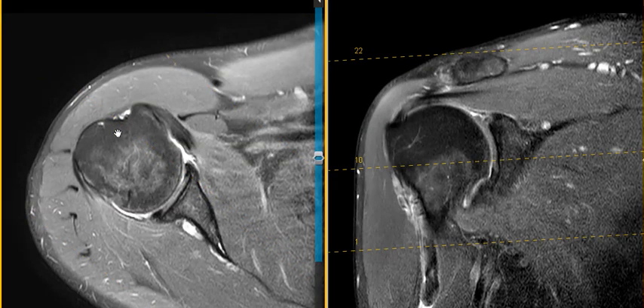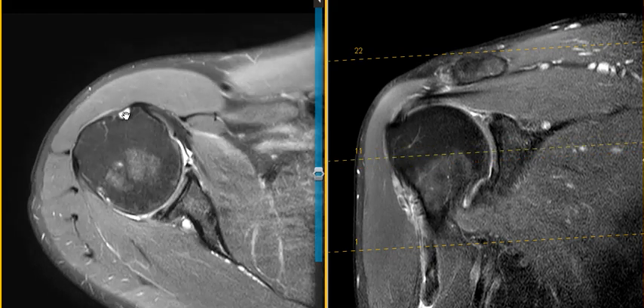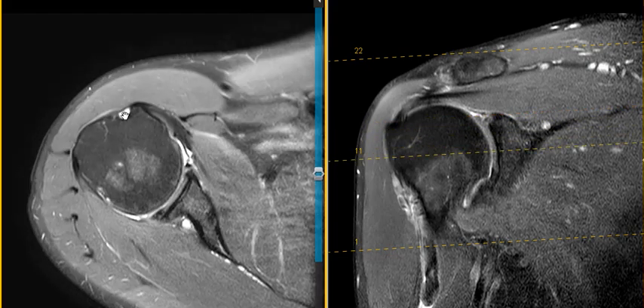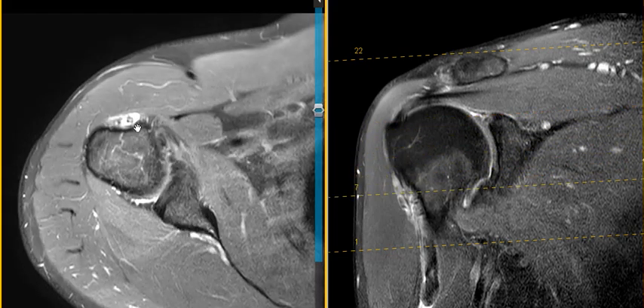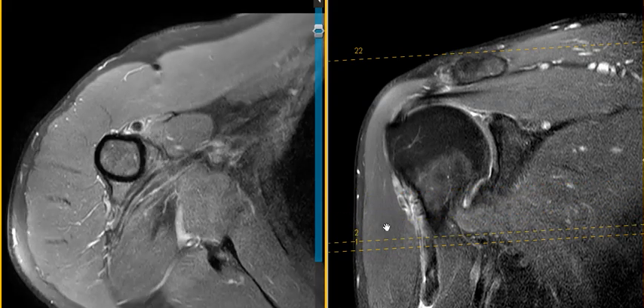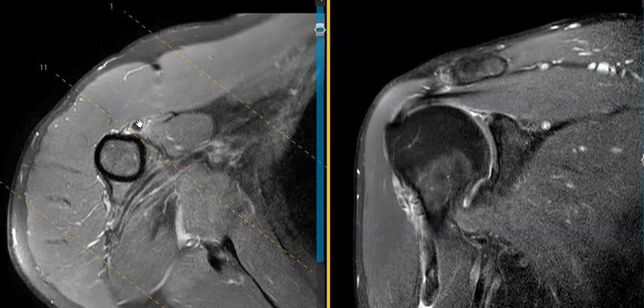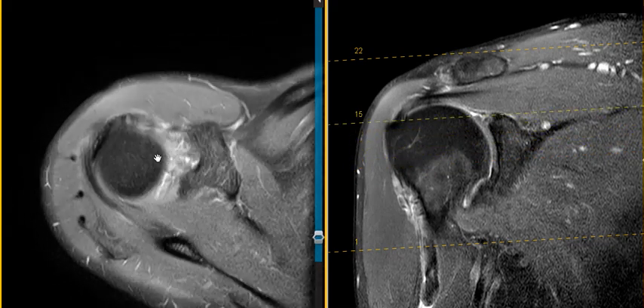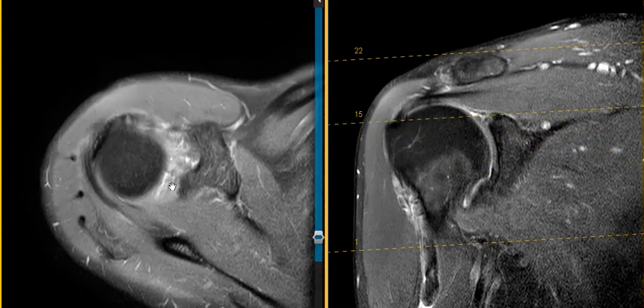On this axial image we can see the same thing. This is the bicipital groove — normally we should see the biceps tendon sitting right here as a little round ball, but instead we see a little area of fluid: an empty bicipital groove. If we go up to the top, this is where the biceps should come off and go around — again it's absent. As we go down, we start to see the biceps tendon come back. This is a very low cut where we see the very end of the retracted biceps tendon.